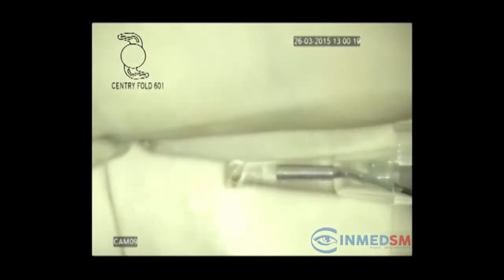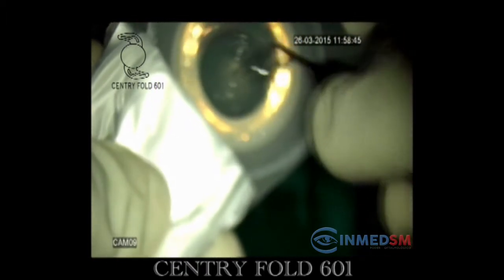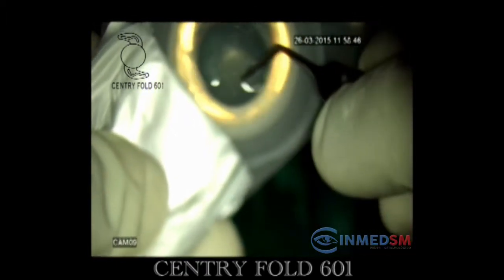The cartridge is primed initially by injecting the viscoelastic material. The Centry Fold model 601 lens is taken out of its blister pack, washed with saline, and placed in the cartridge.